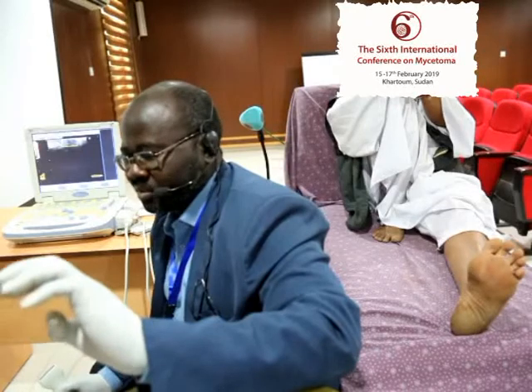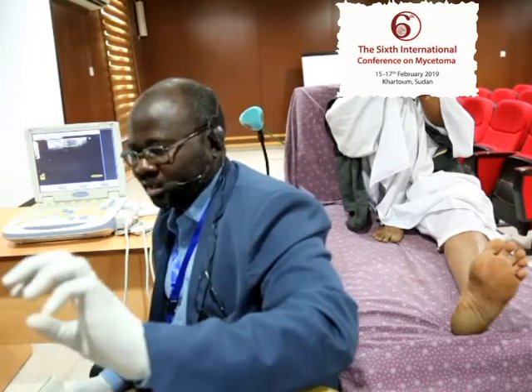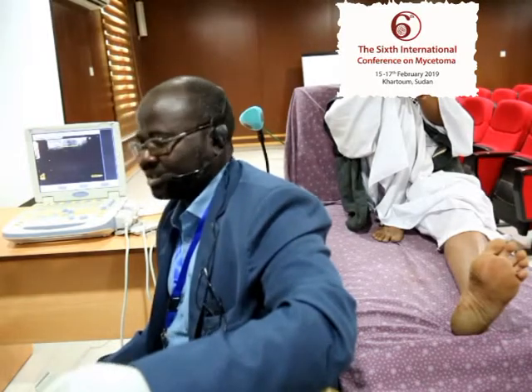Whereas a grain or grains of actinomycetoma show fine echogenicity. You might see just a haze of echogenicity. Sometimes we see an echogenic lesion without definable grains. Still, it goes with an actinomycetoma. And of course, a point that I would like to emphasize: at the end of the day, we have to take a biopsy, and it will tell us the final diagnosis.